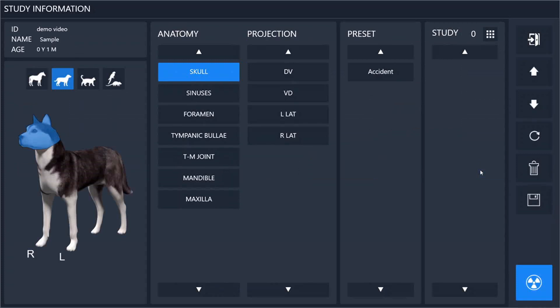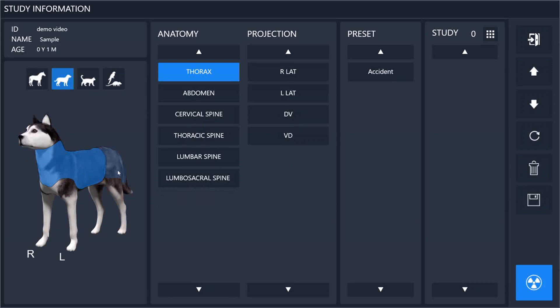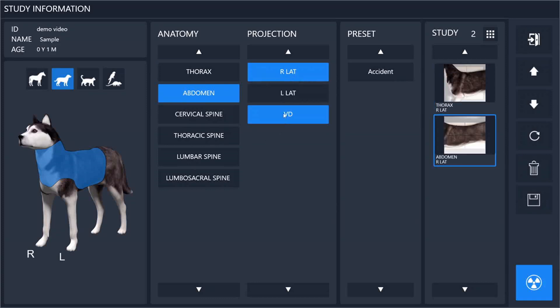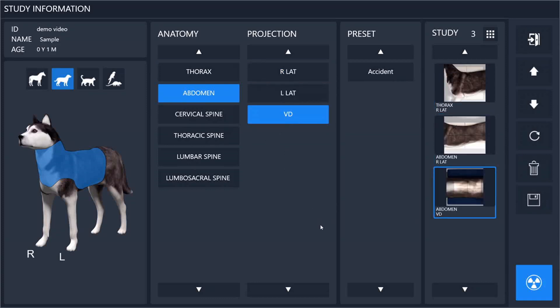Here you will select exactly what X-rays you are going to take. You can simply select from the picture of the animal the general area and then select the X-rays you are planning to take. I will select a right lateral thorax, a right lateral abdomen, and a VD abdomen. You can also create preset exams — these are exams where when you click on a single button it will fill in multiple X-rays for you, so you do not have to repeatedly enter your most common exams.